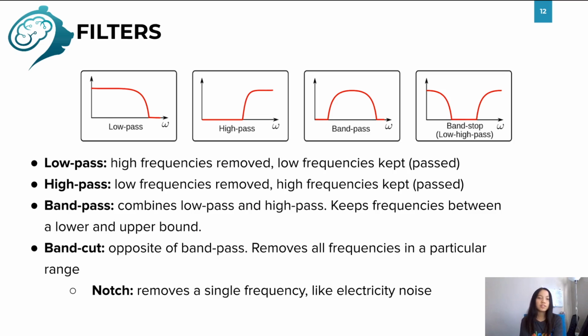Alright, so this is another very important pre-processing step. So we would want to filter EEG data in order to make the data look cleaner and easier to interpret. And it can also be used to reduce some noise. Here are some of the types of filtering that can be used for any types of signals. You might have encountered some of these already.